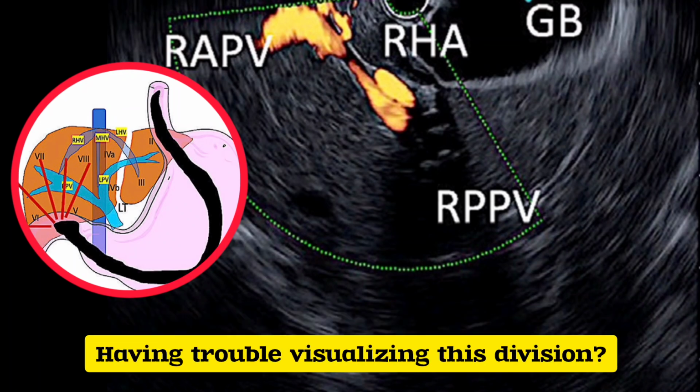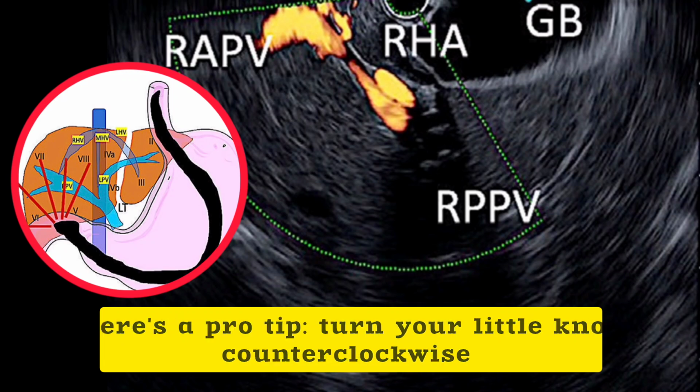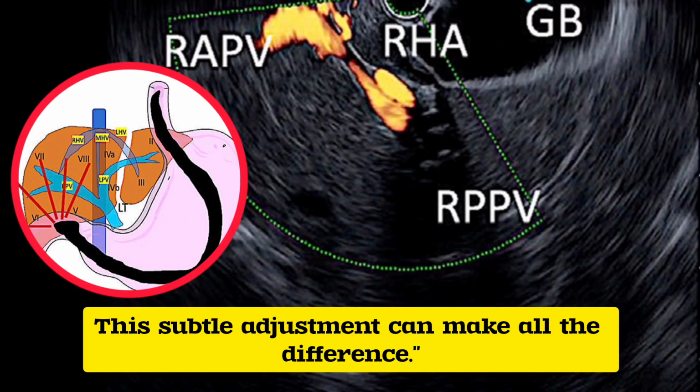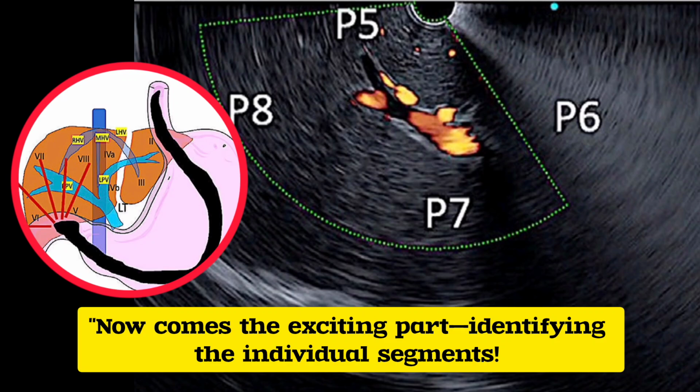Having trouble visualizing this division? Here's a pro tip. Turn your little knob counterclockwise and gently pull the scope back against the pylorus. This subtle adjustment can make all the difference. Now comes the exciting part, identifying the individual segments.